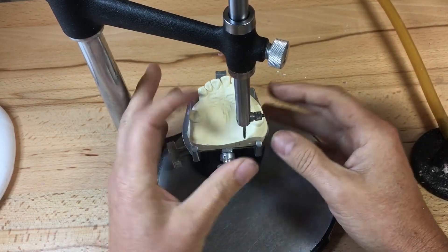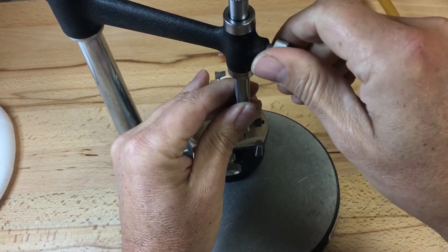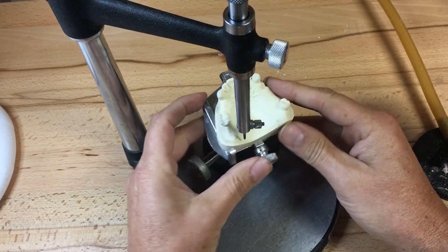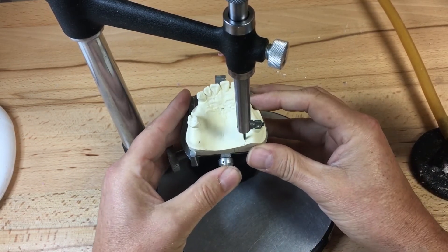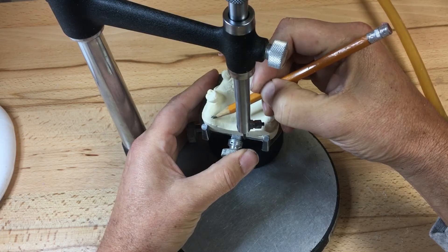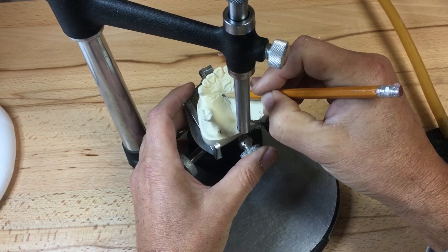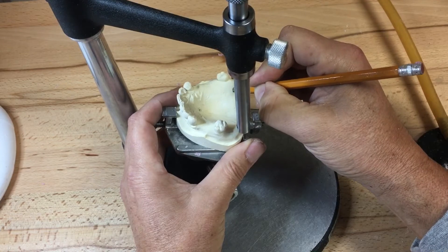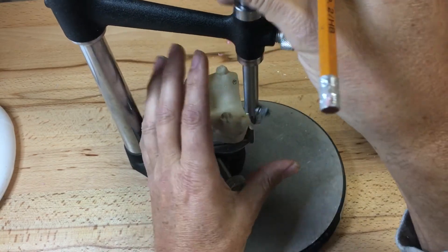I need to lock the vertical member of the surveyor. I'm going to make the graphite a little bit tighter. One, two, and three. I'm going to take my graphite pencil and cross those lines and circle them — this is about a three-millimeter circle, not too small, not too large, as to take away from the drawing we're going to do on the model. So we have a tripod and a path of insertion dictated.